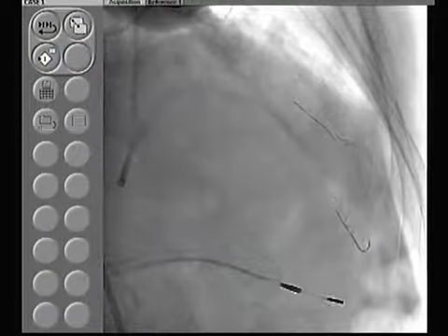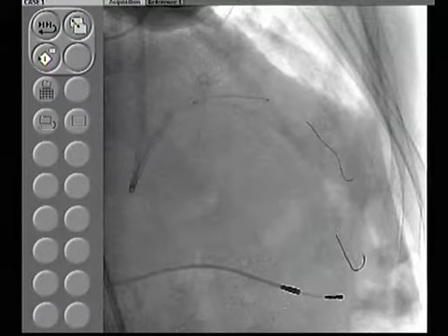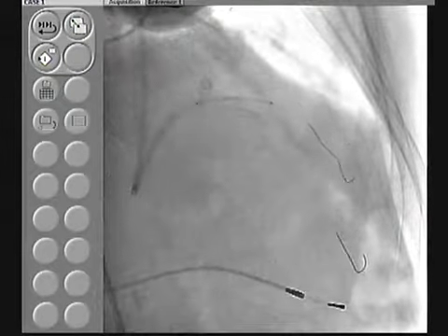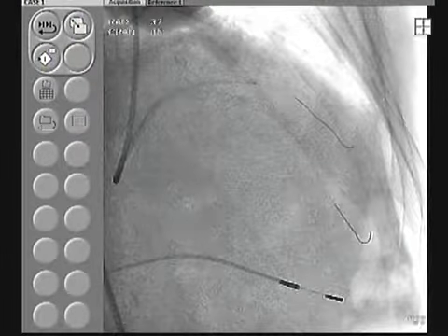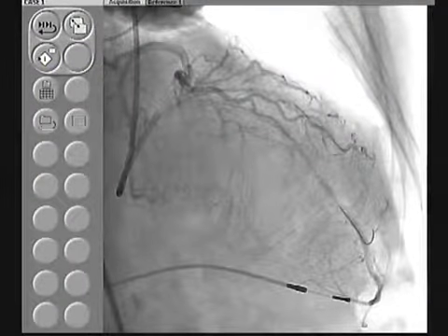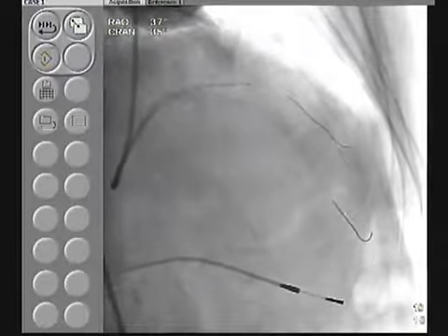Samir, you pointed out early that there was a lot of disease in that mid to distal LAD. It clearly was. So now, I think this alone will not cover that area. Let's go distal. The diagonal stent is clearly covering both the segments, so yeah, we are good. Proximally, how far do you have to come back? Good. Then fine, leave it there.